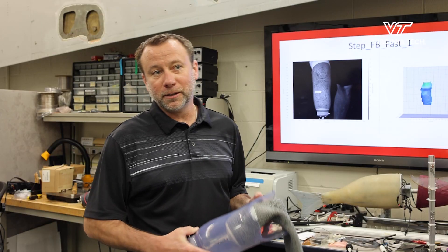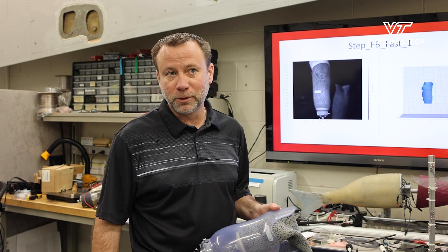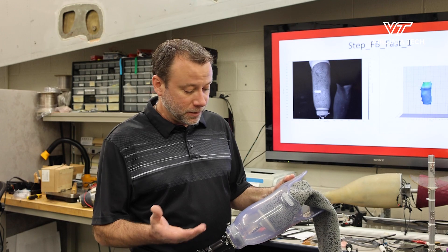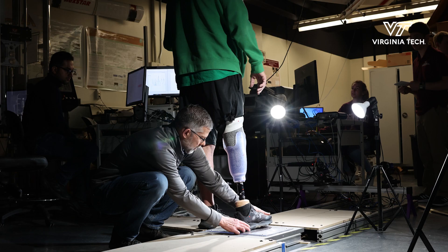This research is currently funded by the Army, and one of the focuses is on improving the socket comfort of prosthetic sockets. Most people with an amputation suffer volume changes during the course of the day, which can result in pain and discomfort.